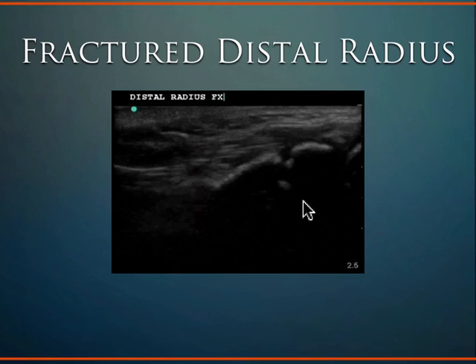So when you're doing an ultrasound, you put so much gel on it. You can get gel out of the refrigerator. I always keep the bottle in the refrigerator. So you can put some chilled gel on there, and then you don't even touch the skin. The ultrasound touches the gel, and then it's actually painless to do an ultrasound for a fracture, as long as you're not moving the bone. Once you start moving the bones around, then the patient will let you know about it. For sure.